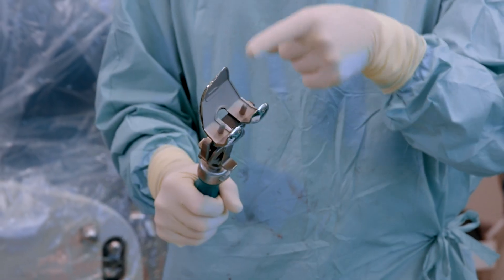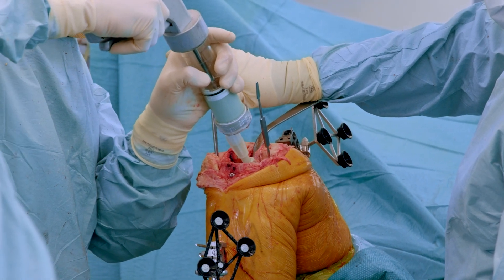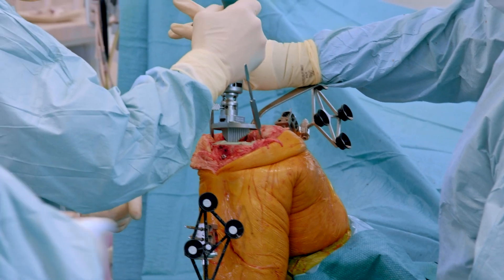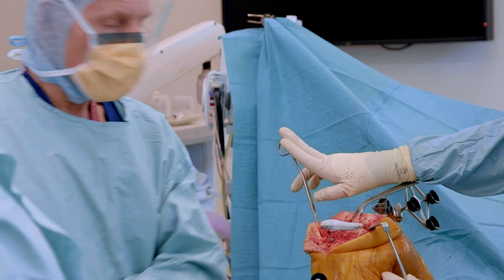It enables me to really focus on providing that patient with a functional knee replacement, which means that in six months or a year's time, when people ask the patient how their knee replacement is, they look slightly bewildered and say, 'Oh, you mean the one I had replaced? It's fine.' This is the shiny femoral component that sits on the end of the thigh bone — that's the bearing surface, highly polished and very hard. This is the piece of plastic that goes between the two. One of the fantastic things about using a robot is that it provides consistency — highly accurate and highly consistent — whatever day you come to theatre, you have the confidence it will deliver the plan you set out to achieve.